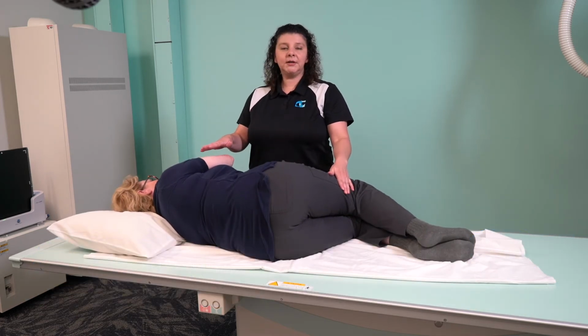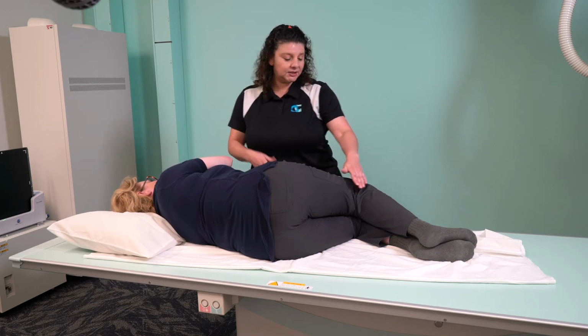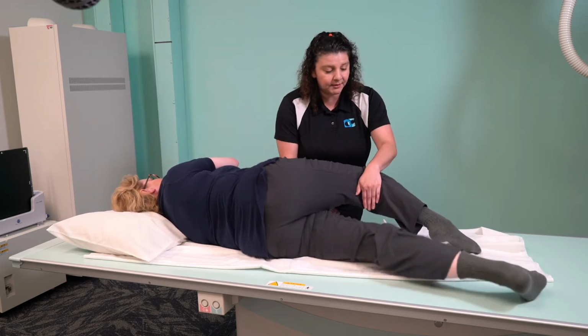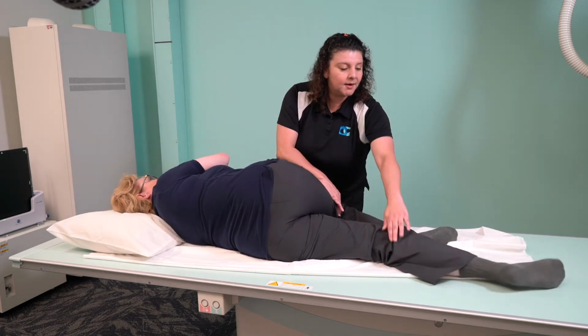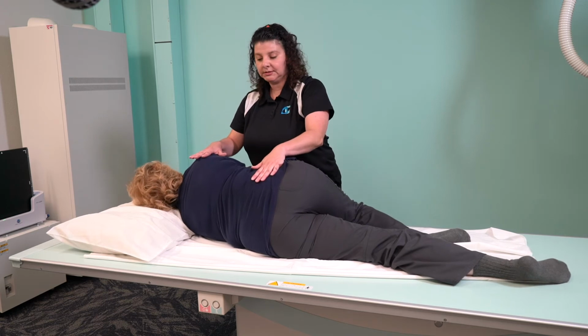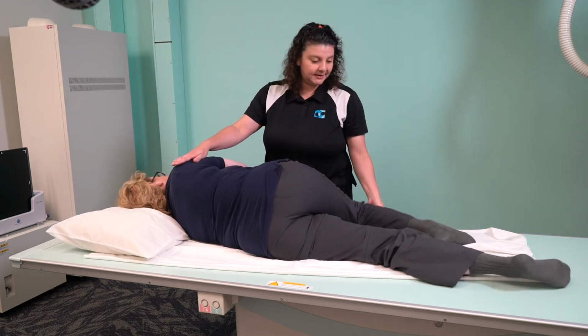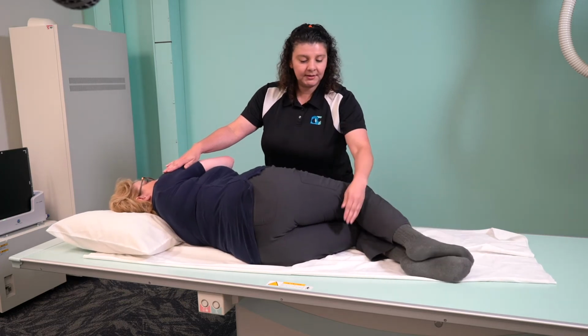The other position that we're going to cover is a Sims position. This is when she is in an oblique position with the top leg bent and the bottom leg straight, and you just roll your patient forward. So this is a Sims position. Okay, if you will stay on your left side. So I'm going to put her on her left side.